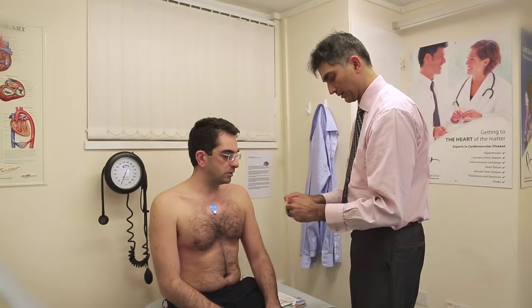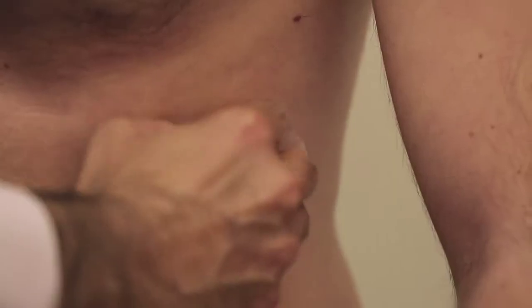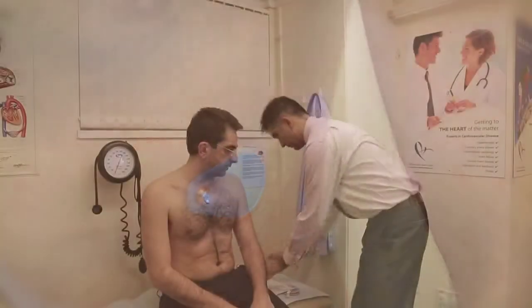Most patient symptoms occur intermittently, and doing an ECG in the clinic room might not always capture the problem. With an ambulatory ECG monitor, we're looking to see what the rhythm of the heart is and how it varies over the space of the 24-hour or 48-hour period that the patient's wearing the monitor.